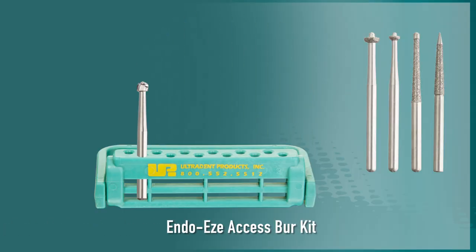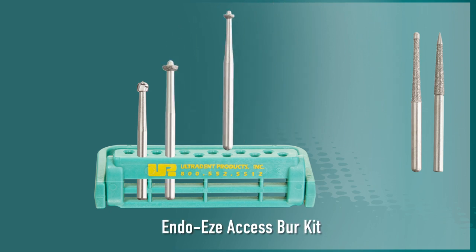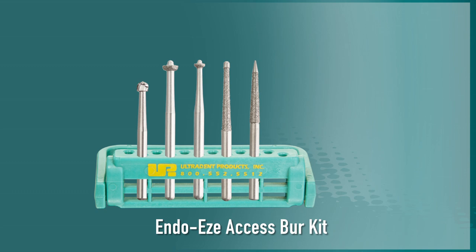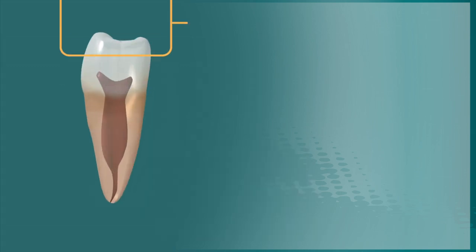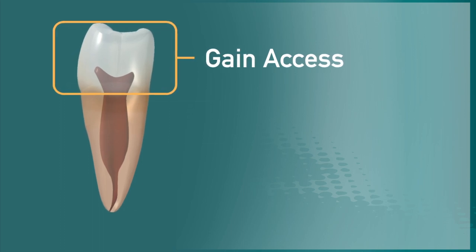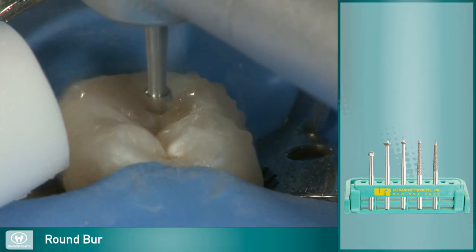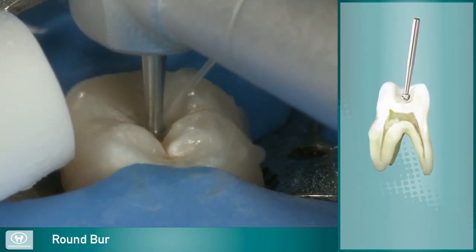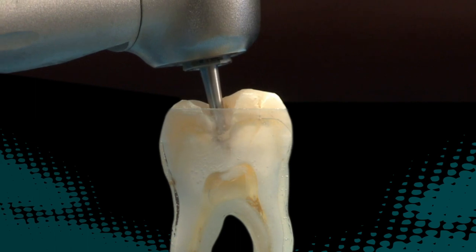The EndoEase Access Bur Kit comes with a round burr and four unique high-speed access burrs, each designed to perform a specific role in safely creating pulp chamber access. Step one in the endodontic procedure is to gain access to the pulp chamber. The round carbide burr is used to quickly cut through the occlusal table of the tooth, exposing the pulp and pulp chamber.